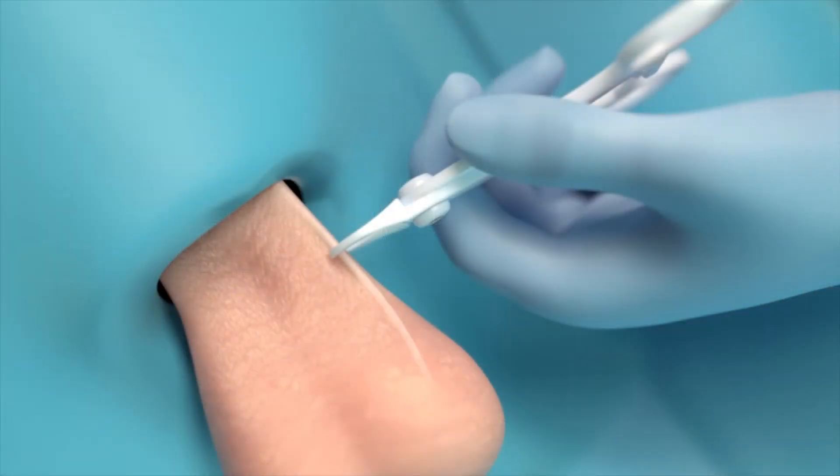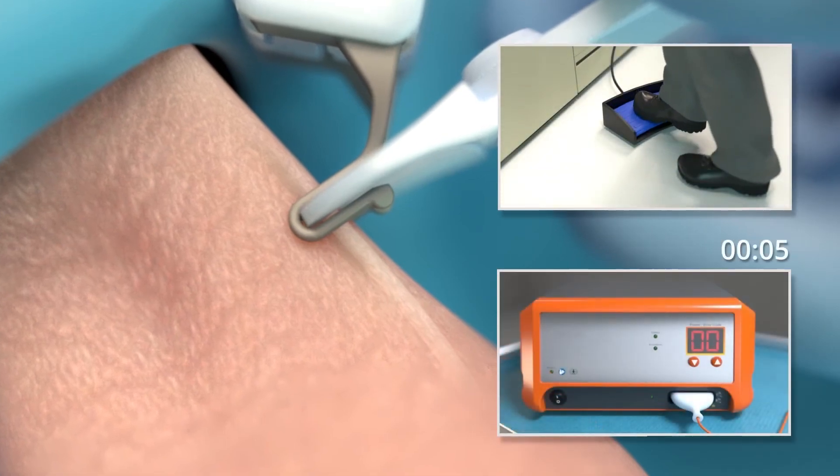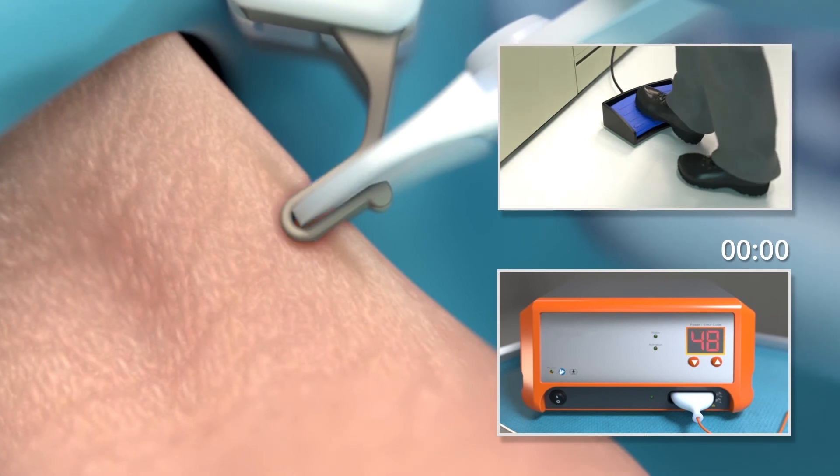More importantly, what we're able to build into our generator is an algorithm for tissue impedance. You'll clamp on with our proprietary jaw, hit a foot pedal, actually listen to a tone, and you know you're done when it's done — your generator is going to tell you. It is an absolutely amazing way to do a vasectomy.